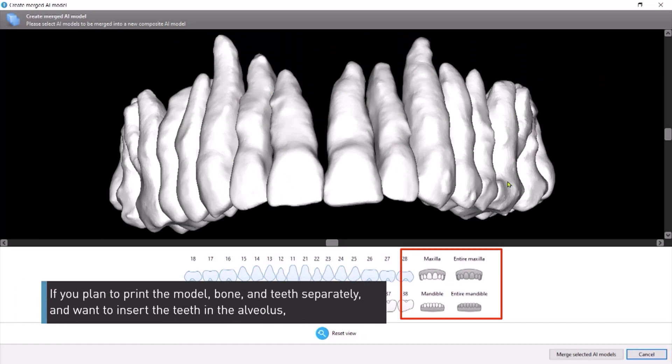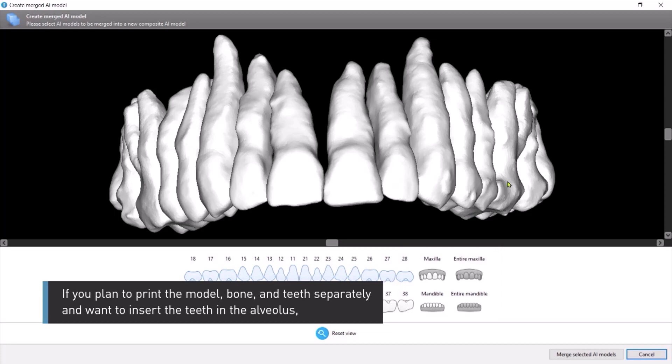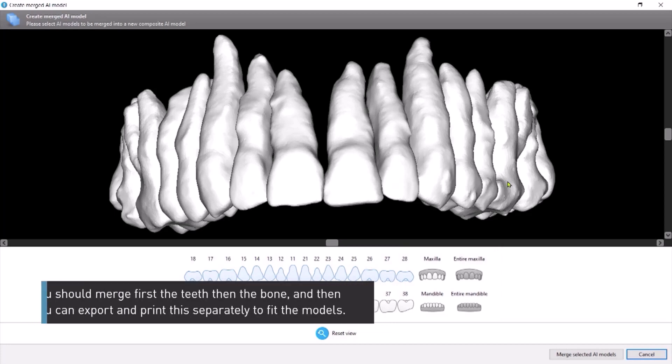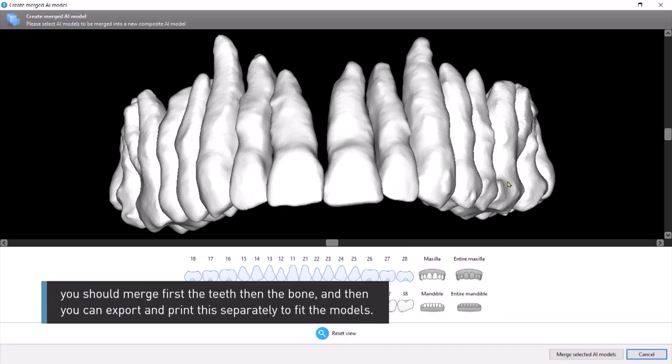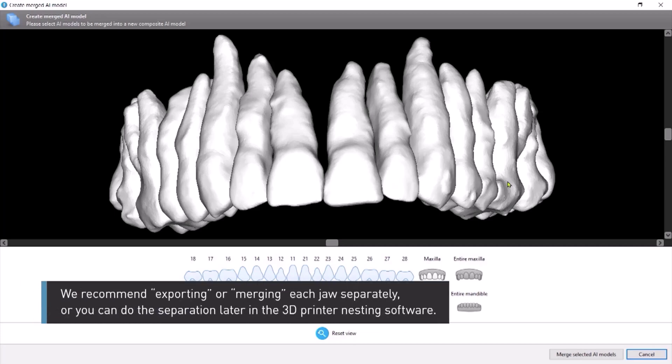If you plan to print the model — bone and teeth separately — and want to insert the teeth in the alveolus, you should merge first the teeth, then the bone, and then you can export and print these separately to fit the models. We recommend merging each jaw separately, or you can do the separation later in the 3D printer nesting software.